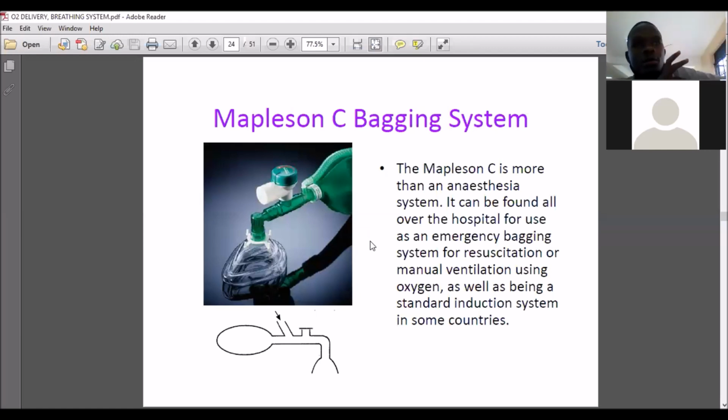So they make a higher oxygen concentration in the valve. Then you can push it in. That's why we are using it. The new fresh air, what you breathe in, and when I press, they all go through. So even the incoming air can be concentrated first. Then I press it, and it goes through to you in large volumes. So the Mapleson is what we use mostly in hospitals. Those things have valves, but until I read this, I had not even realized they are there. If you look, you see the cover of the round thing on top.